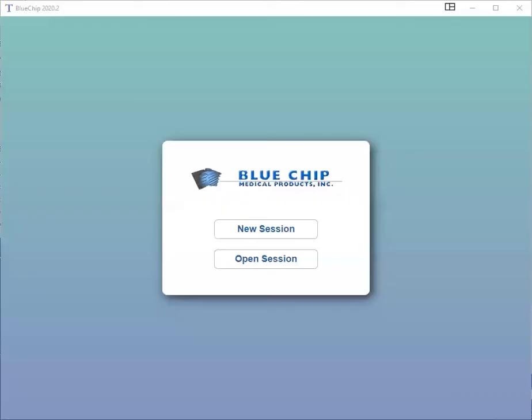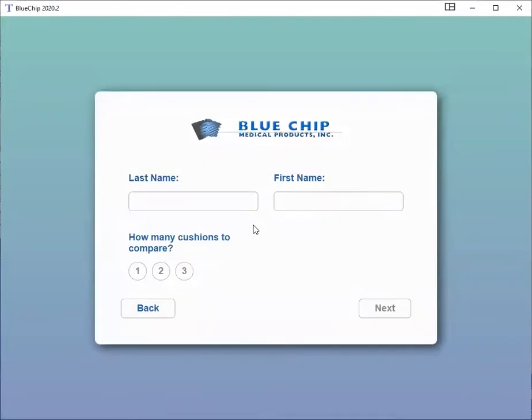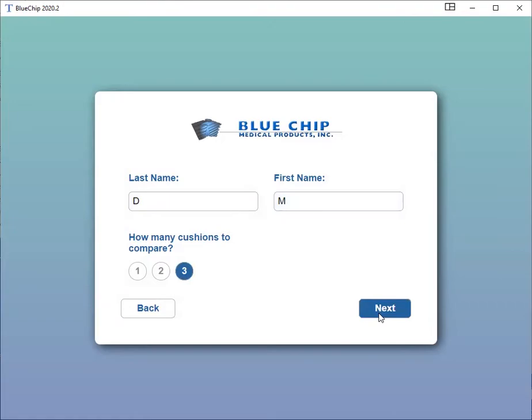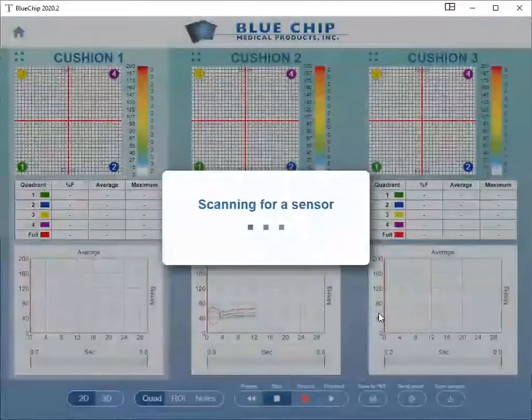To begin, click New Session. Enter the patient's last and first name. Then select the number of cushions you will be comparing and click Next.